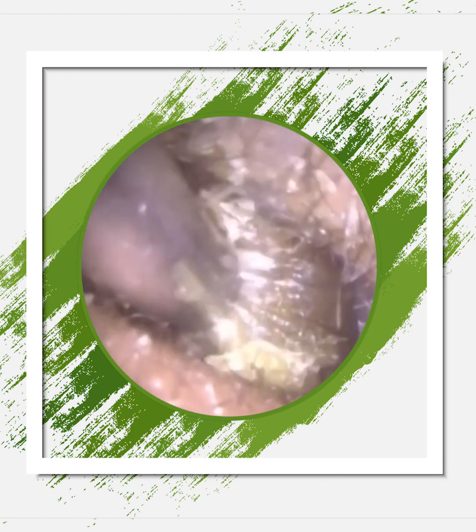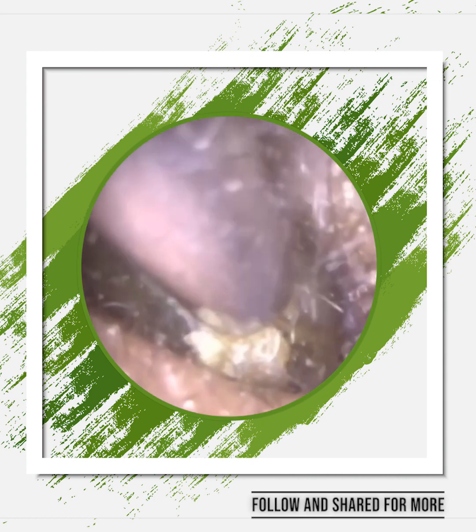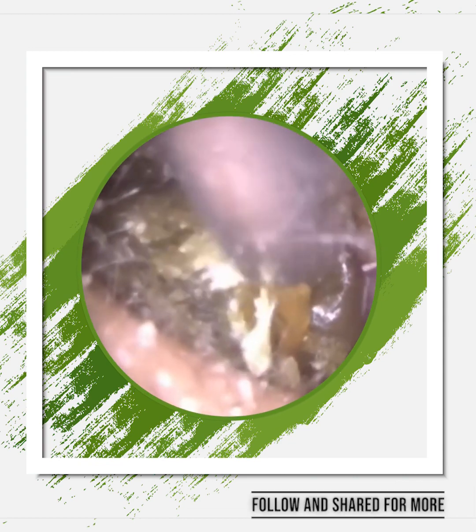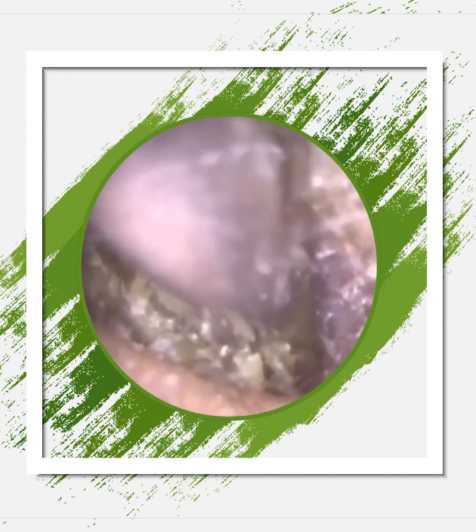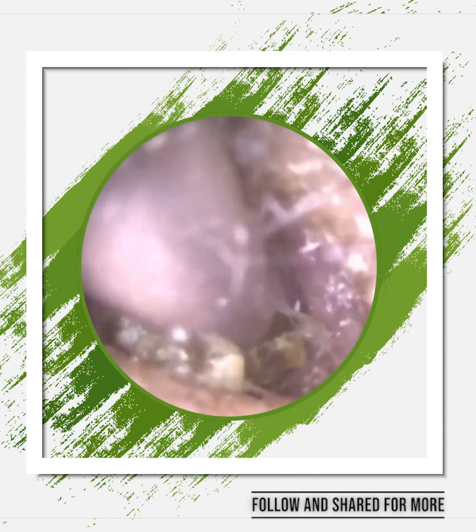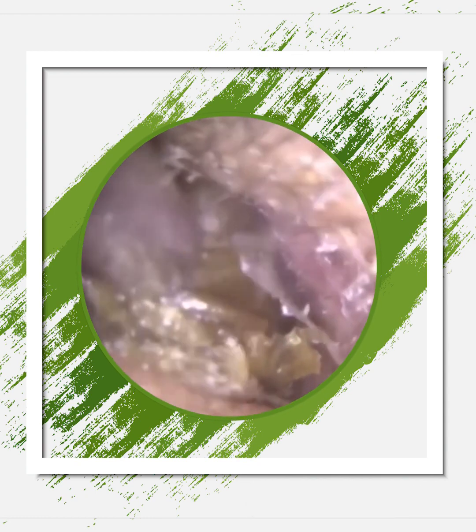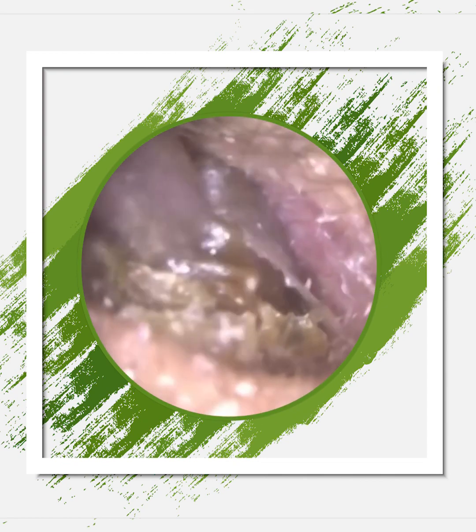I had a patient who actually attended today, and I was really keen to get this video uploaded tonight. Attended with bilateral fully occluding dry earwax. The patient also has otitis externa of both ear canals. Otitis externa is an umbrella term for an infection or inflammation of the outer ear canal and the outer layer of the eardrum. So we're just performing the procedure on the left ear first.